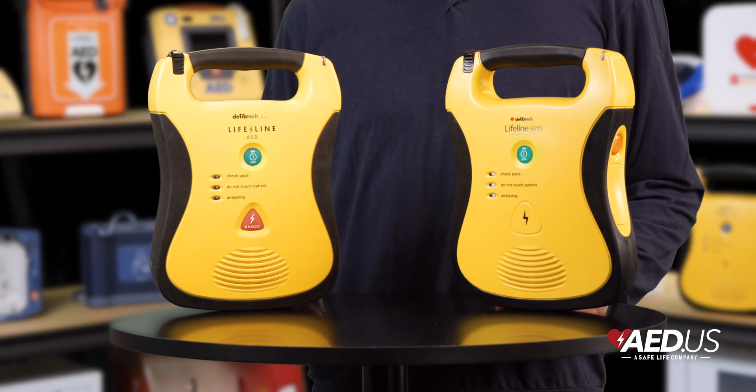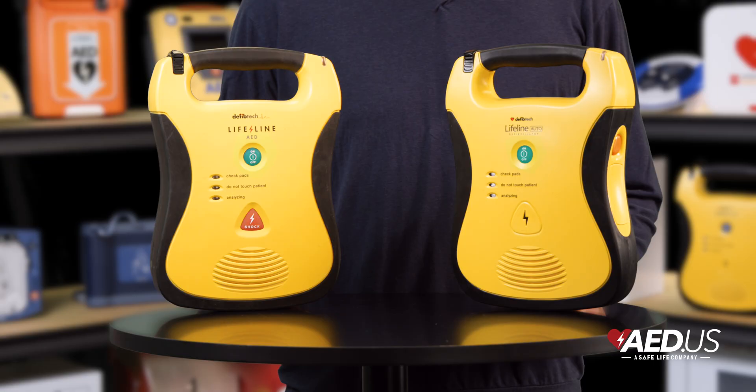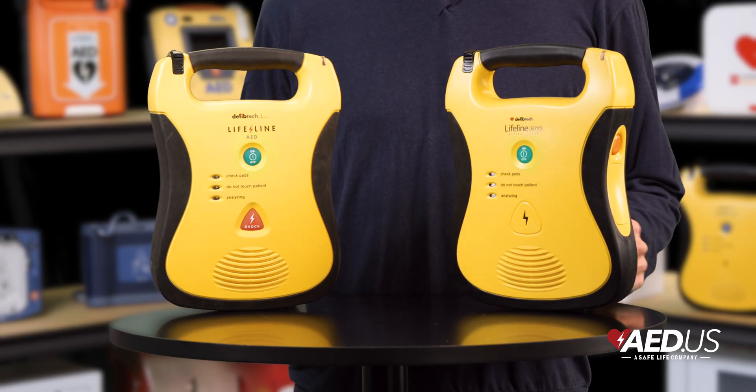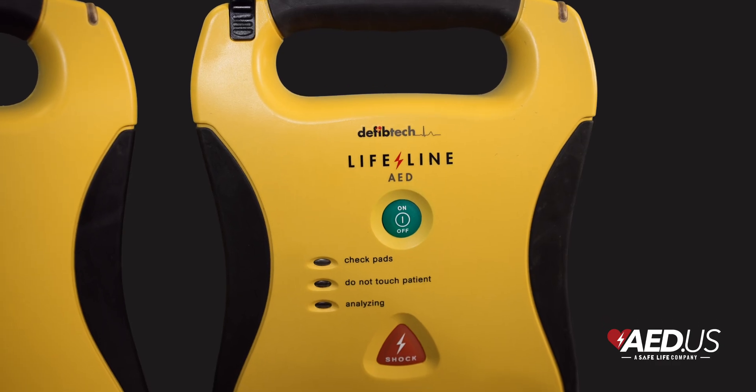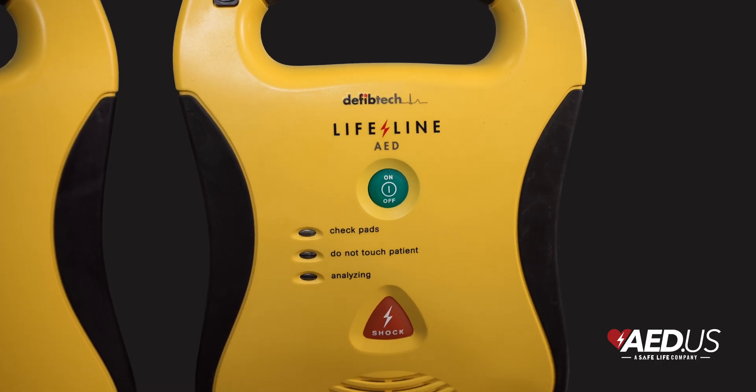With an IP54 rating, the device is resistant to dust and water, making it equally suitable for indoor or outdoor use. This rugged design ensures the Lifeline AED can handle a variety of challenging settings.